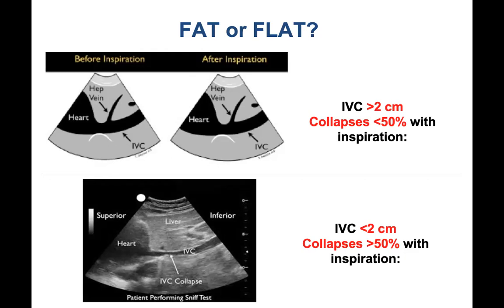Now, everybody always wants numbers, so I did include them here. But again, this is just an overall generalization. I certainly would not use 2 as my tried and true cutoff.